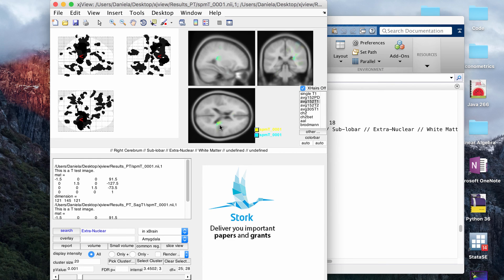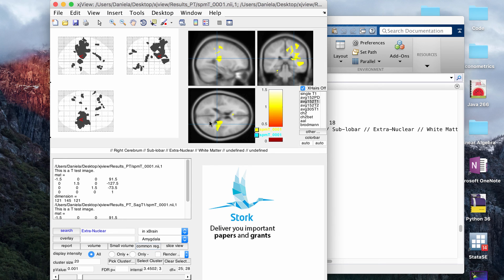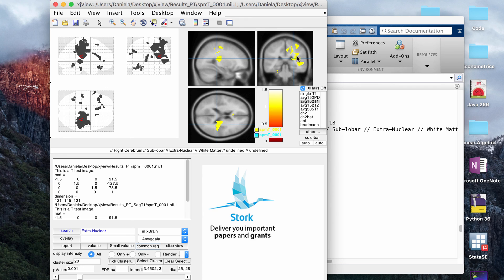You know, if you can't pick exactly which regions are common to both overlays, well, you don't have to because there's a common region button here that's also really useful, and it will pick out where the two images are common. Again, it's showing you that the schizencephaly shows up on both scans, and the whole thing is pretty much... and also this area as well, which I guess... I don't know if that's part of the schizencephaly or not, but it's showing up pretty conclusively that this area is abnormal.